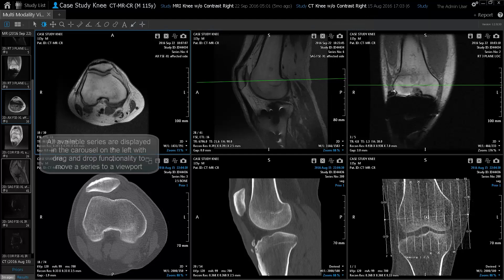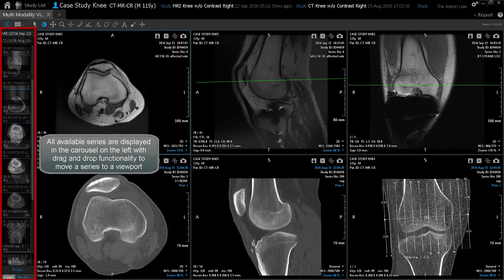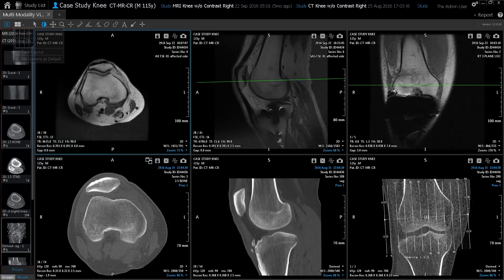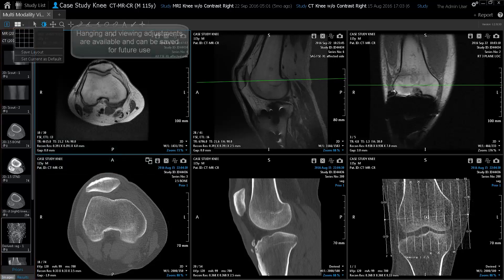All available series are displayed in the carousel on the left with drag and drop functionality to move a series to a viewport. Hanging and viewing adjustments are available and can be saved for future use.